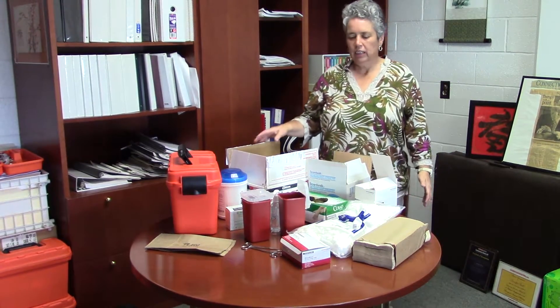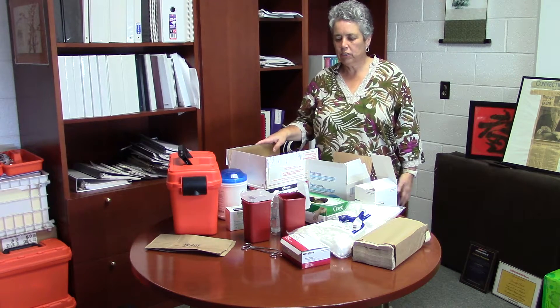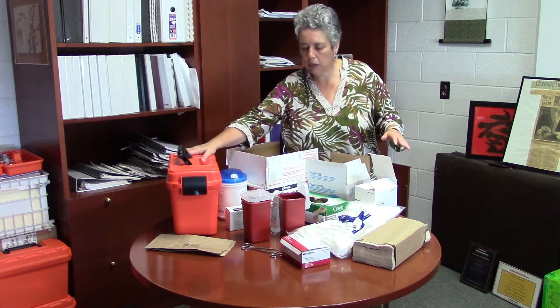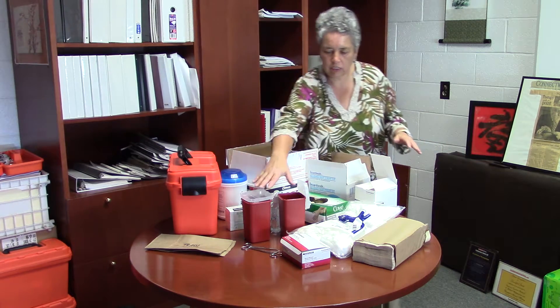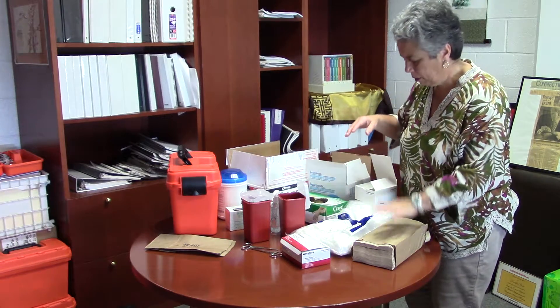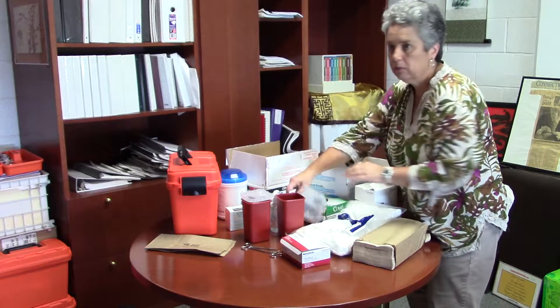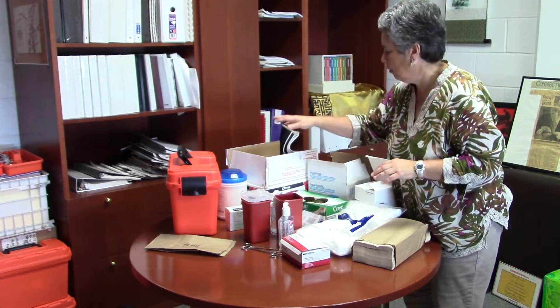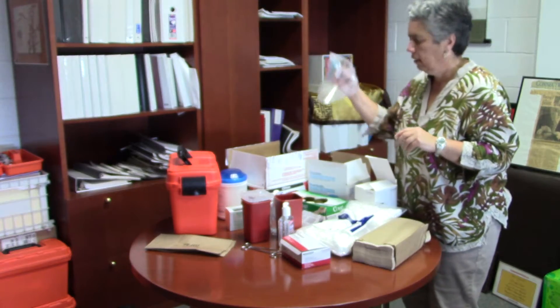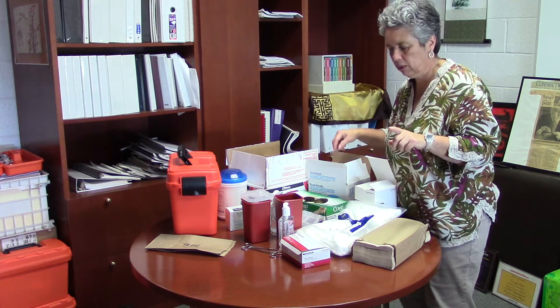Welcome to clean needle technique kit preparation. First thing to do is make sure you have all your supplies: your kit box, your needles, your sharps container, alcohol swabs, cotton balls, paper towels, gauze, gloves, Purell. You're going to need gallon sized Ziploc bags — at least five — and quart size at least three, but we're going to use six the first time.